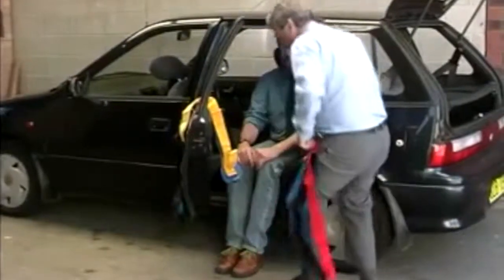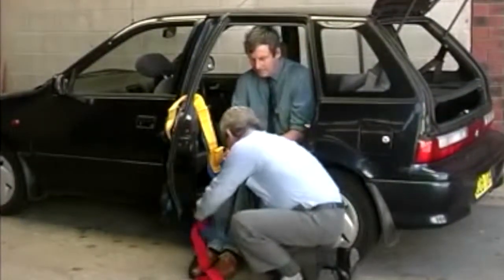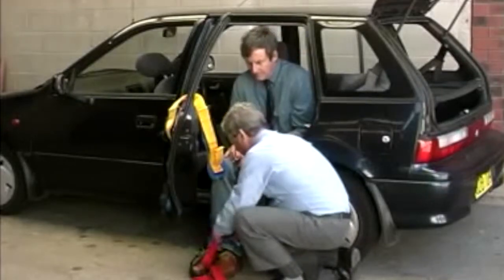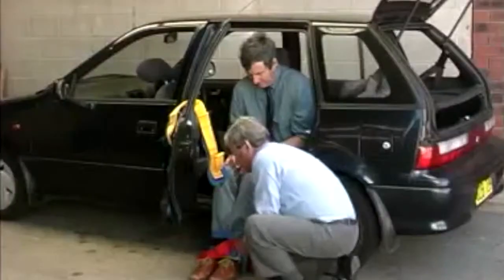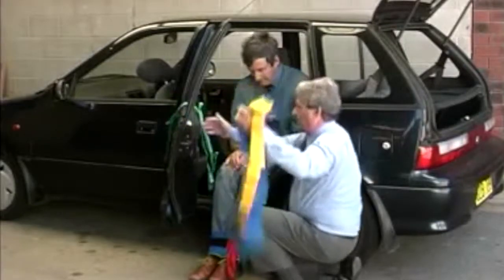Here we demonstrate putting the straps on. The red strap is wrapped around the person's ankles. The velcro is threaded through the loop and secured. Next is the yellow thigh strap.